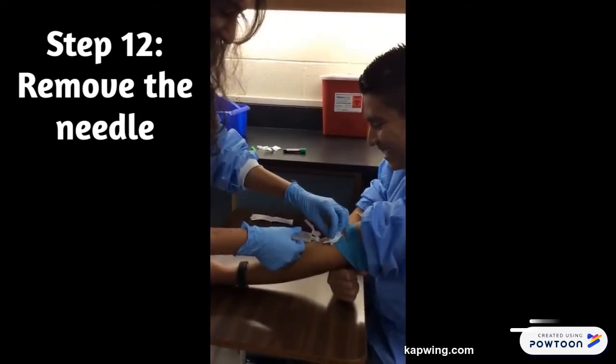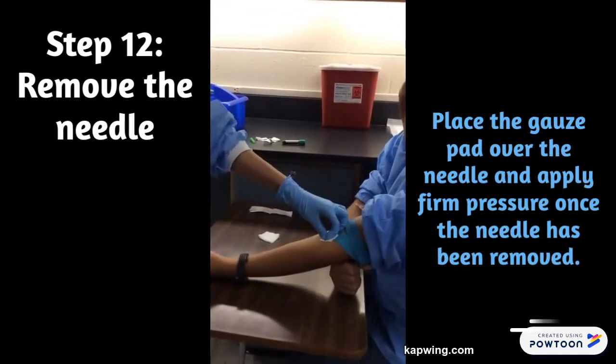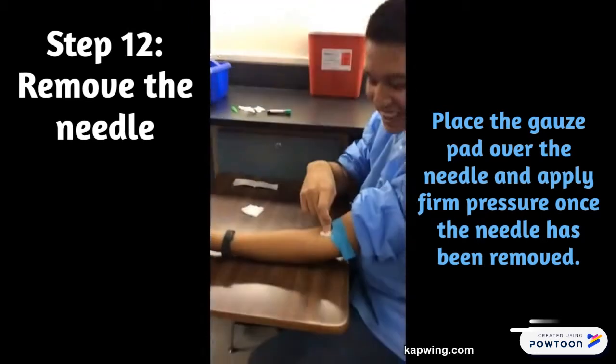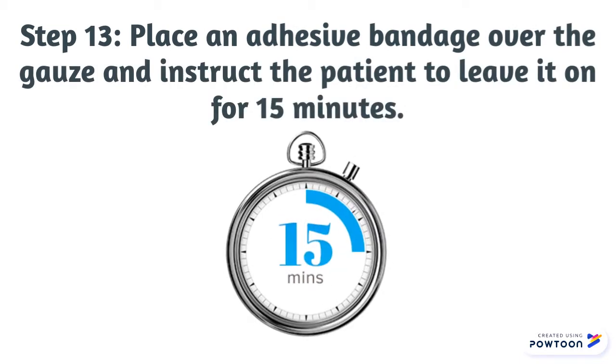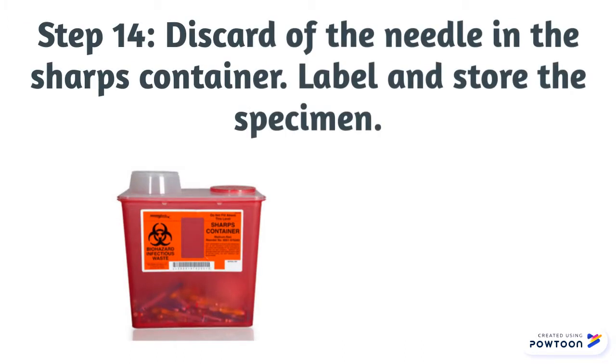Remove the needle at the same angle that it was inserted. Place the gauze pad over the needle and apply firm pressure once the needle has been removed. Place an adhesive bandage over the gauze and instruct the patient to leave it on for 15 minutes. Discard the needle in a sharps container after the procedure is complete. Label the specimen and centrifuge or store it as necessary.